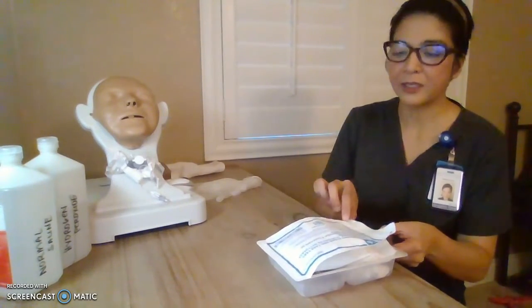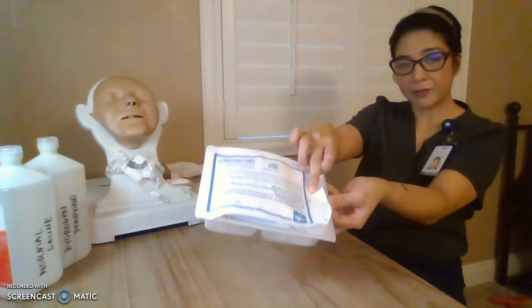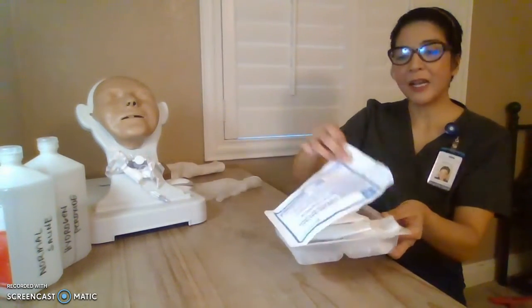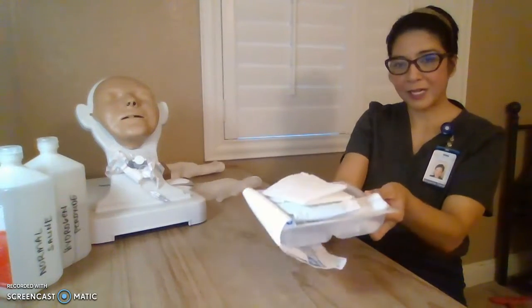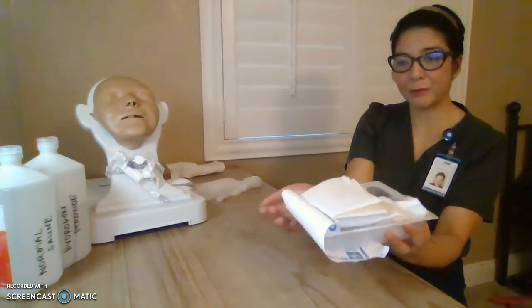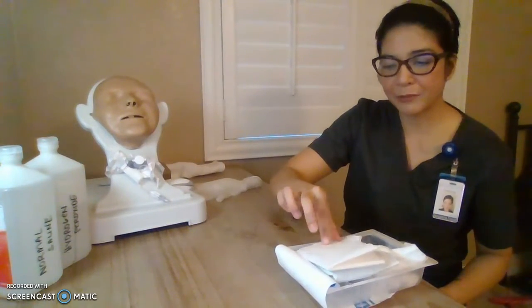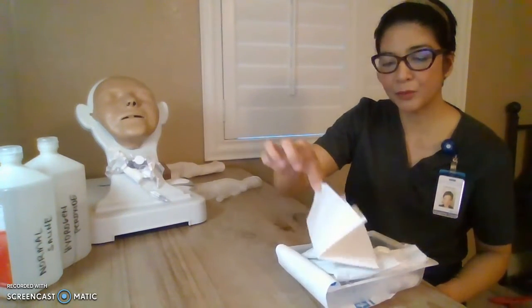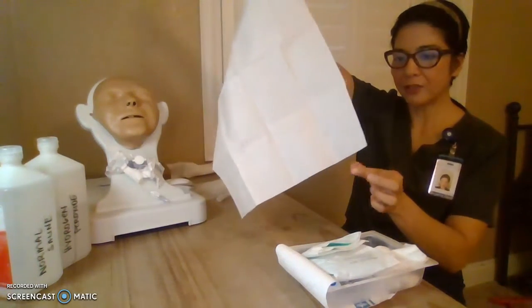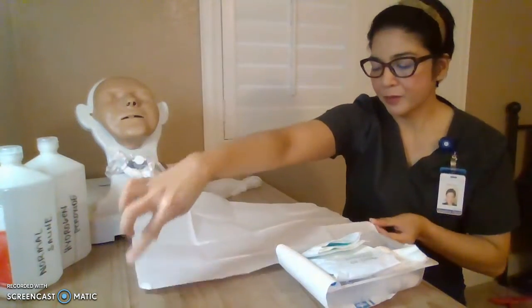Talk to your patient. Okay, so we are going to open this sterile tracheostomy kit. It's sterile, supposed to be sealed, okay? Away from you. That is how you open it, and you tear it open. Okay, remove this flap. Set it down. You have your dressing pad, which is sterile. You have an inch border leeway to touch it. Do not let it fly around, and you're just going to drop it on your table.